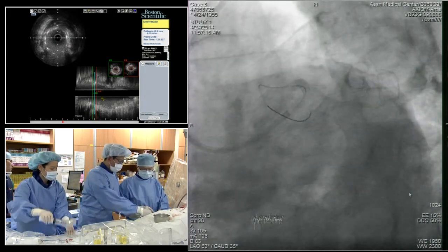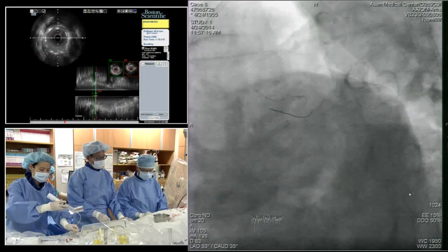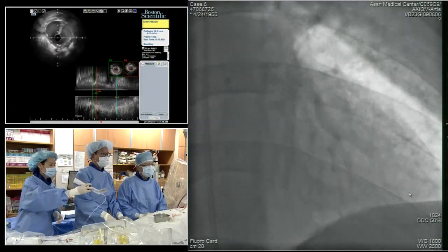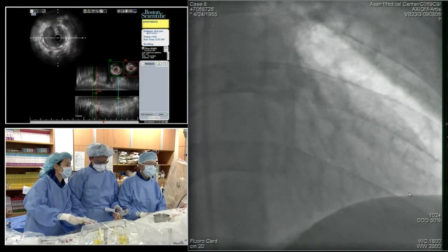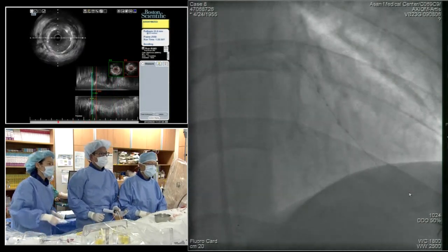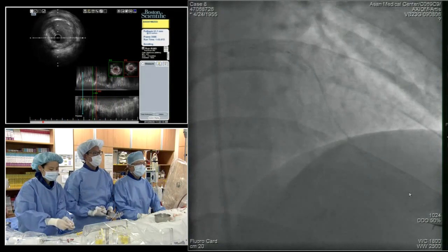I think if the IVUS looks, if the stent looks fully expanded, if it looks like it's fully opposed and circular, then I'm not sure what additional post-dilatation would accomplish. So I agree. I mean, even that hypothetical is not proven to be so with this intravascular ultrasound millimeter to millimeter view. So the Resolute Long stent data was presented yesterday.